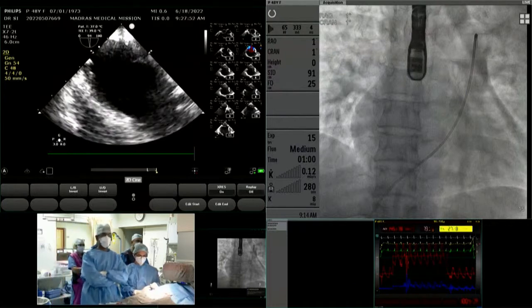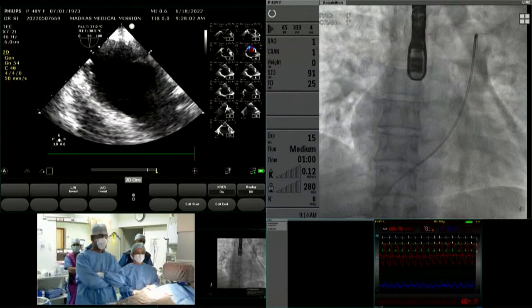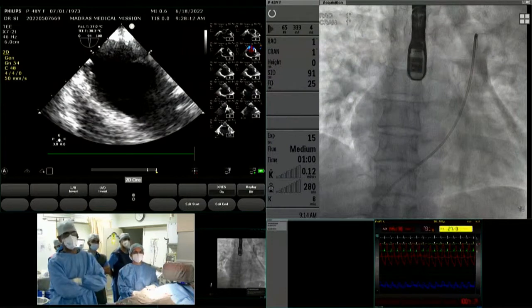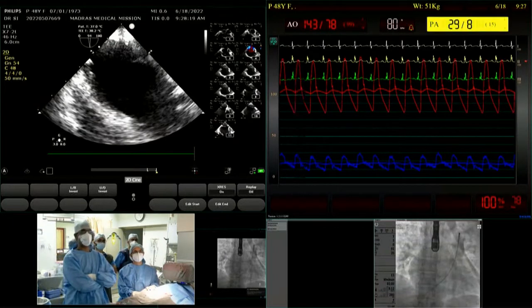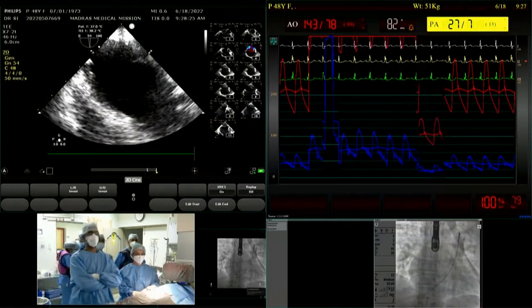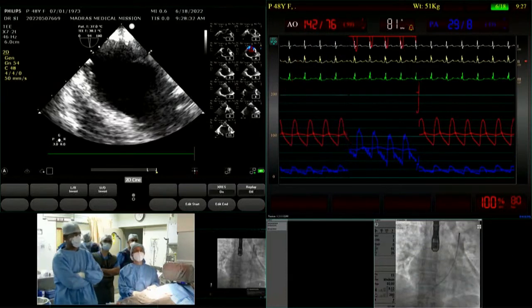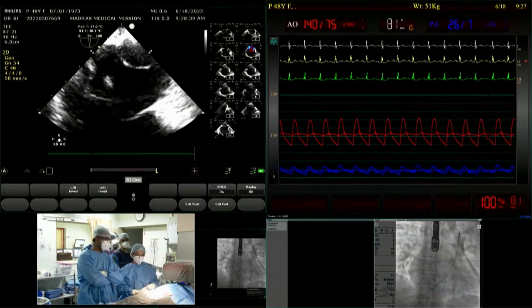Thank you, Pramod. Now we are showing the cath lab. The patient is under anesthesia to facilitate a transesophageal echocardiography. And because the patient is on artificial ventilation, we decided not to do a QP, QS, but we are going ahead with the PA pressures. The pulmonary artery pressure is shown in blue color, which is around 29 by 8 with a mean of around 18. And the aortic pressure is close to 140 by 80 with a mean of 105. We have two venous accesses to facilitate two sheaths from the groin. So on the right femoral vein, that's very good.